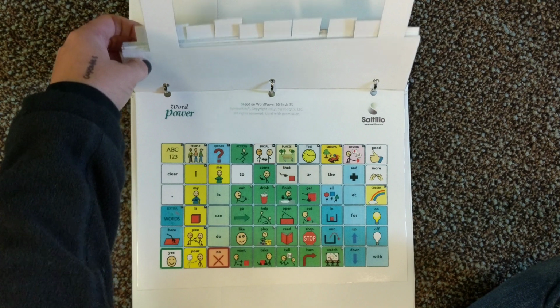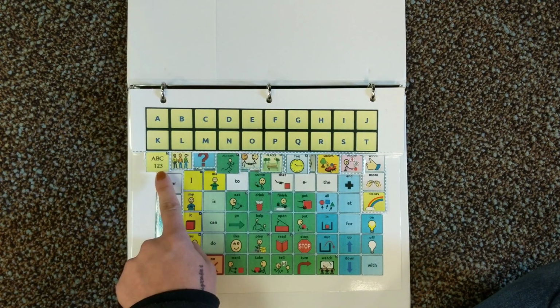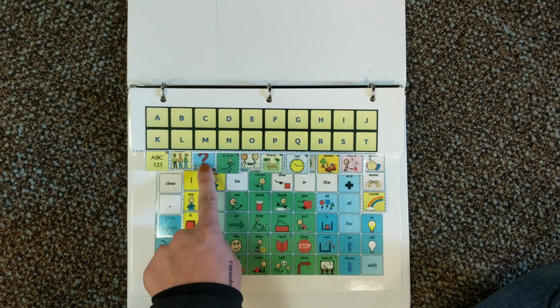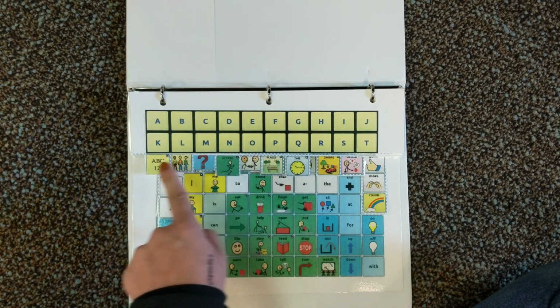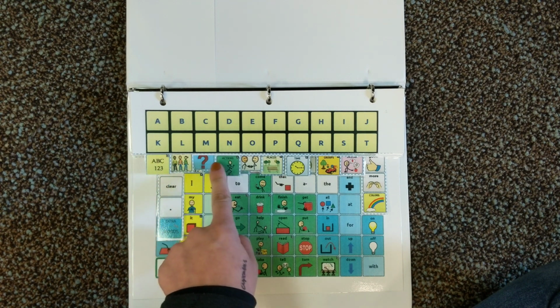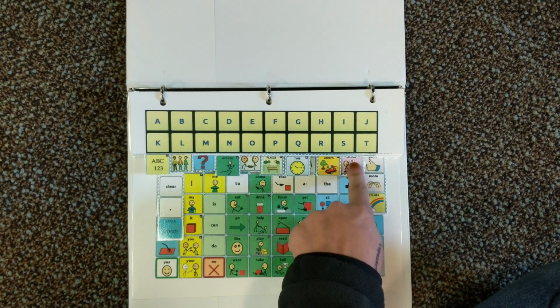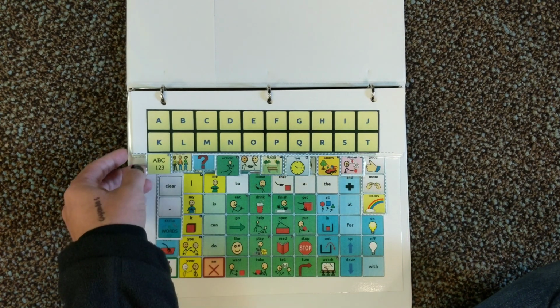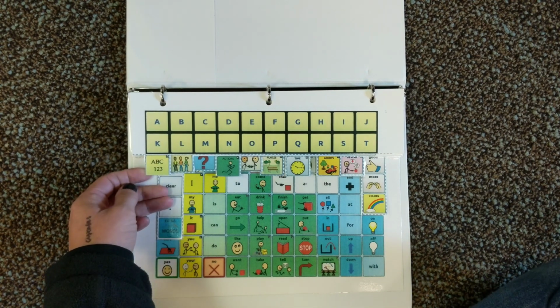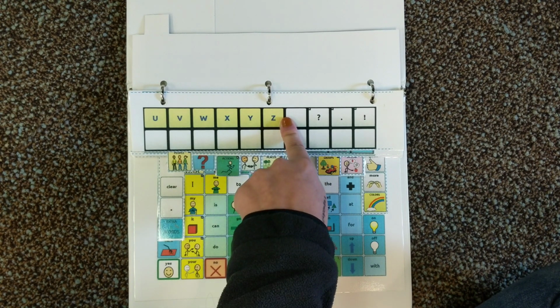So for the binder version, it's a little bit different because these are all flipped on top. And so see, there's that row of what would be buttons on an iPad. So like we said, keyboard, people, questions, actions, social, places, time, groups, describe, and then your good, more, and colors. So then these tabs you can flip. And so if you need to say your letter, you can say the letter.